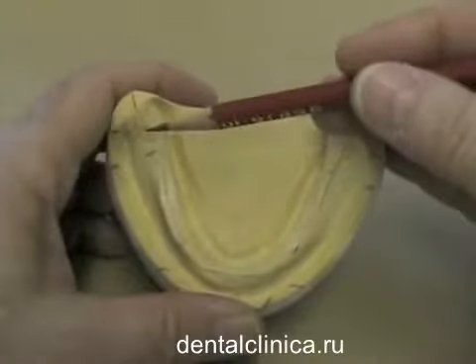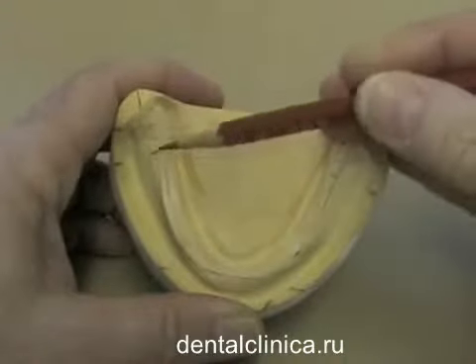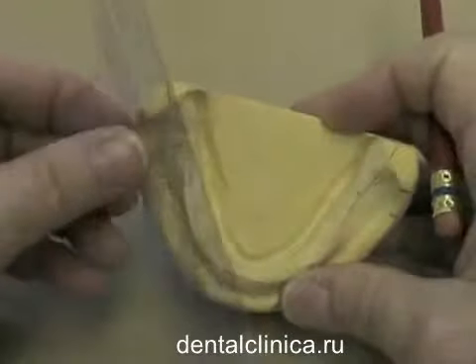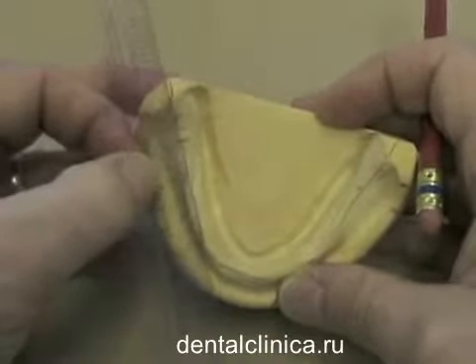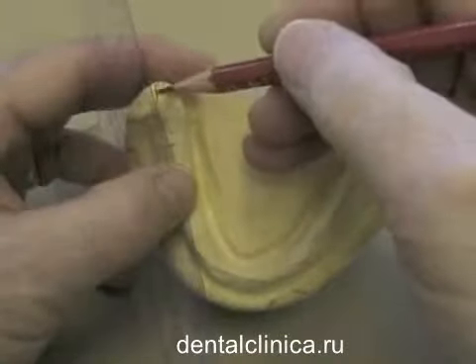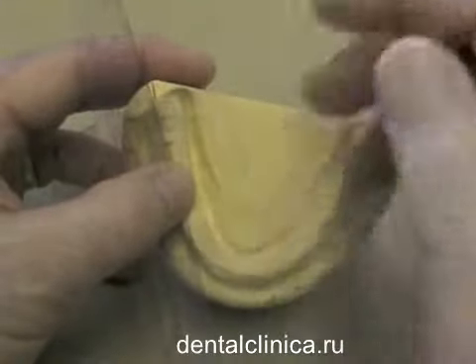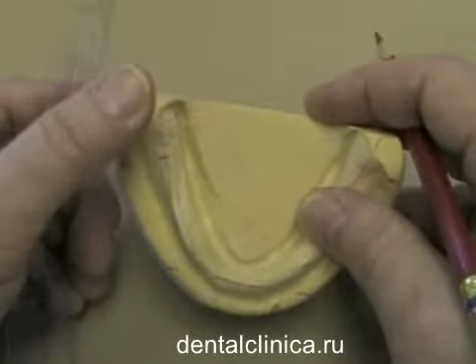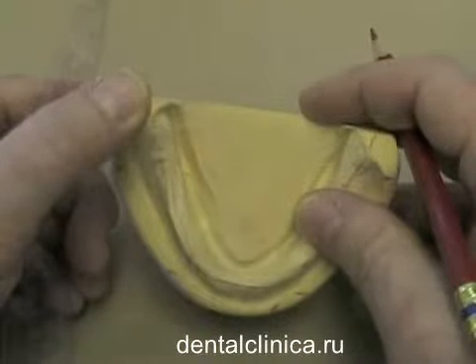You'll find that most ridges have a little bit of curvature. Your object is to find the mean middle of the ridge throughout one side of the arch. The easiest way to do that is to take your True Bite auto rule, which is clear, and center it over in the best way that you can, the center of the ridge, and then to draw lines out on your land area and also continue those lines along the middle of the ridge as you see them. Those lines will help you determine where you want the central fossa of the mandibular teeth and where you want the lingual cusp of the maxillary teeth to fall on.